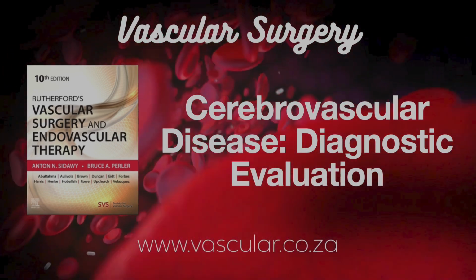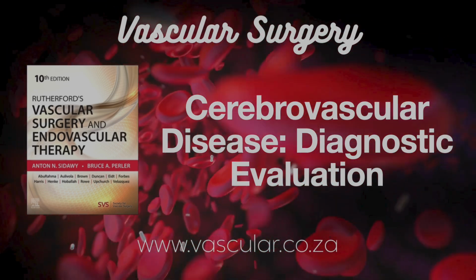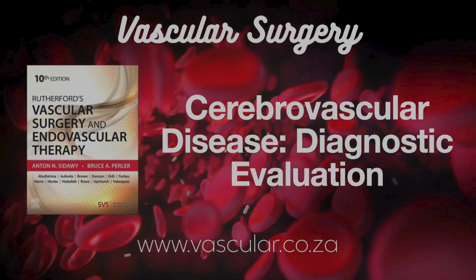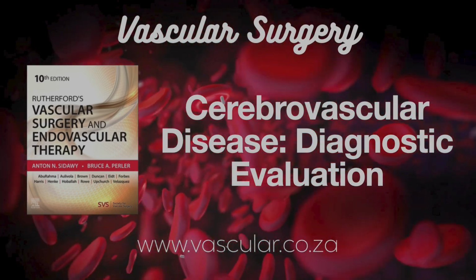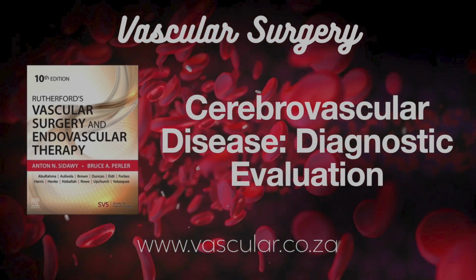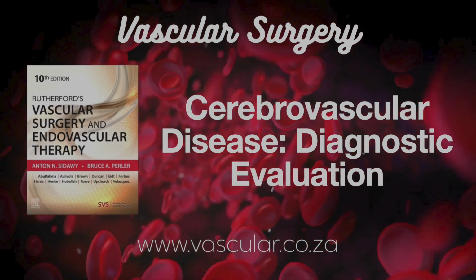The computer takes the X-ray image taken before the contrast went in, showing bone and soft tissue, and digitally subtracts it from the images taken with the contrast filling the arteries. What's left is just a super clear outline of the blood vessels themselves. Clever. And how do you measure the stenosis from those DSA images?